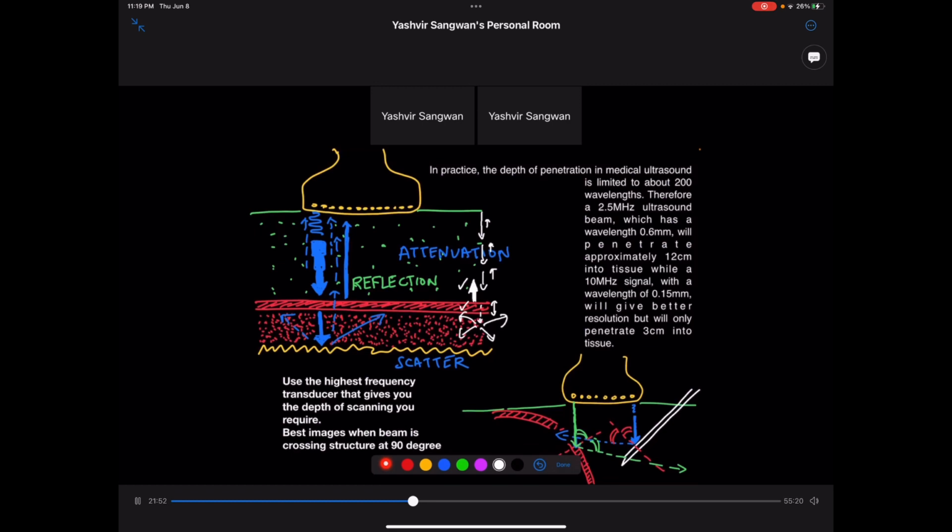It spends more time listening, about 99% of the time, than actually firing, when you look at every individual piezoelectric crystal. Now, one thing is important. Here you have a needle which is coming at a very sharp angle. Okay? And because the needle is metal, it will really reflect sound. Sound comes and hits the needle, and because the needle is really reflective, it reflects at a 90-degree angle and you won't see the needle.